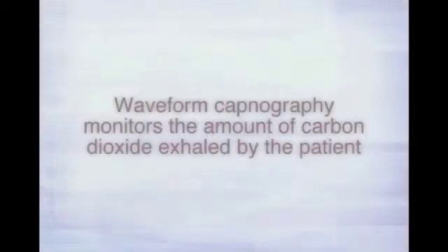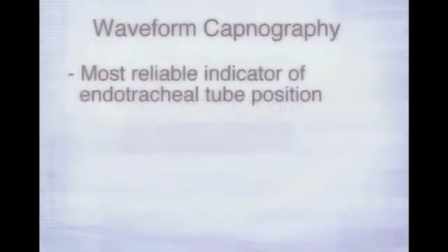The next category of changes relates to managing the patient's airway. The AHA has incorporated several new recommendations into the 2010 guidelines. The first is quantitative waveform capnography. Waveform capnography monitors the amount of carbon dioxide exhaled by the patient. It's the most reliable indicator of endotracheal tube position during cardiac arrest.